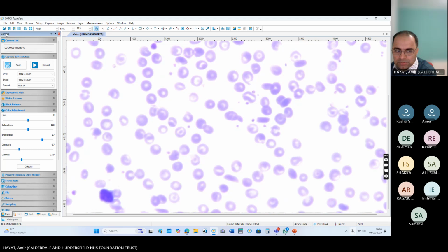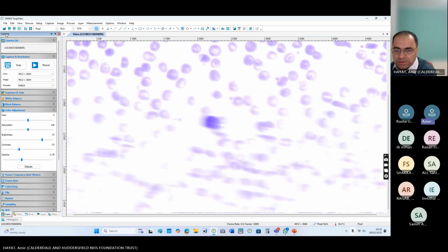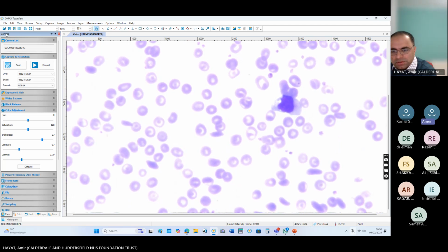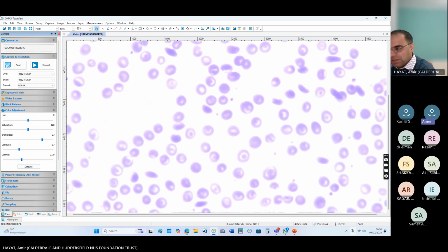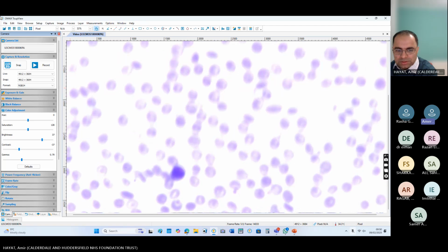So I only commented on the red cell pathology, not on the white cell, because dual pathologies usually do not come in the exam. You may have seen patients who have multiple myeloma plus a CLL phenotype as well, or biphenotypic leukemia, or CML and a CLL phenotype at the same time, but in the exam they do not appear.